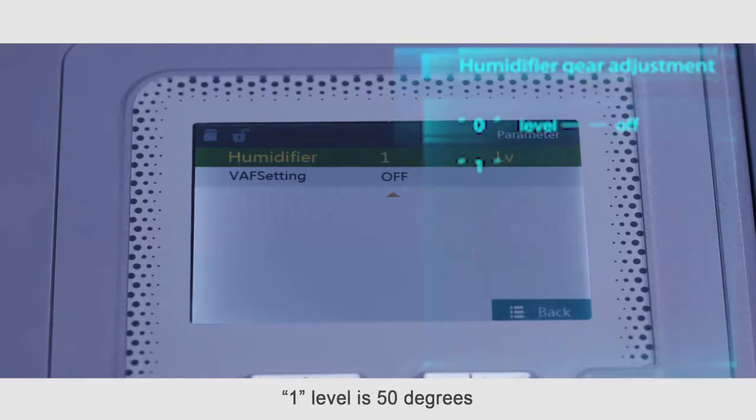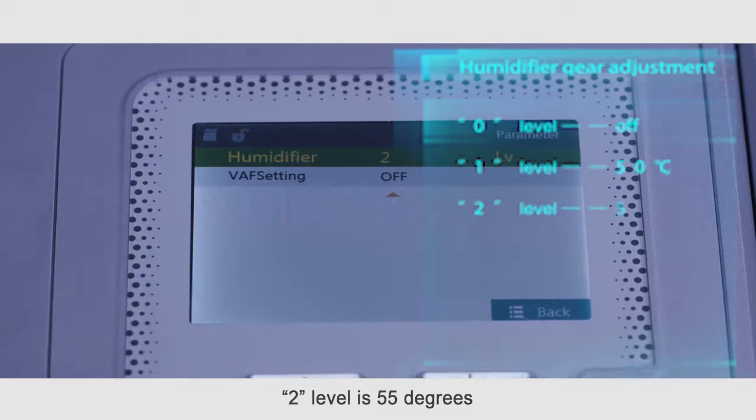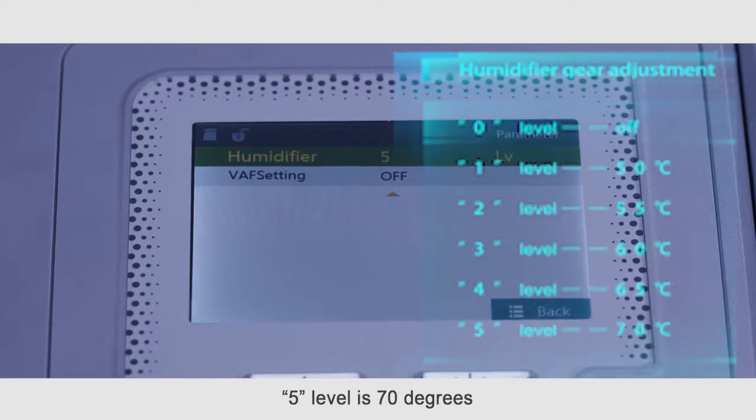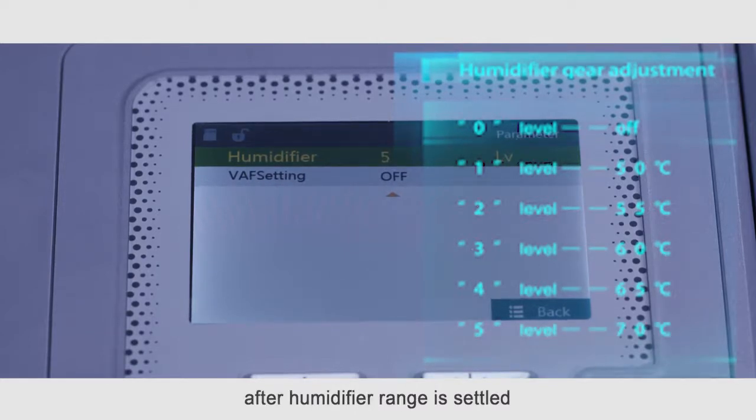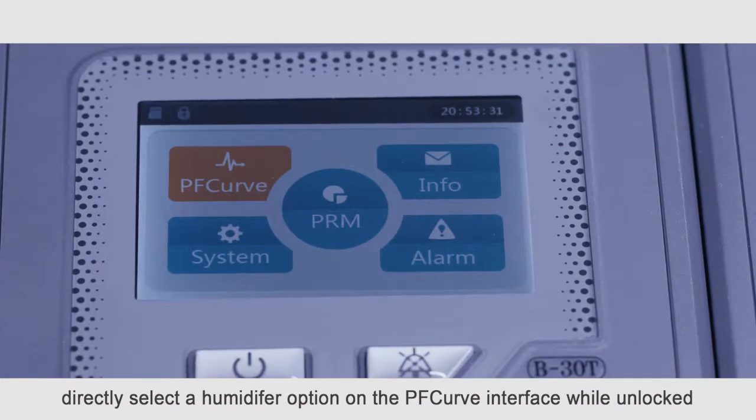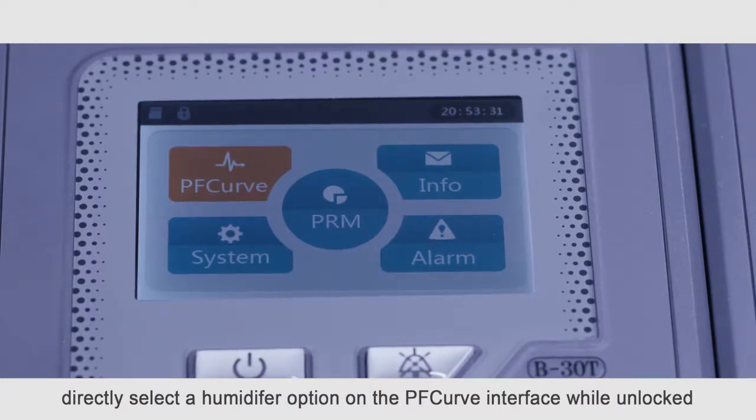One level is 50 degrees. Two level is 55 degrees. Three level is 60 degrees. Four level is 65 degrees. Five level is 70 degrees. After humidifier range is settled, directly select the humidifier option on the PF curve interface while unlocked.